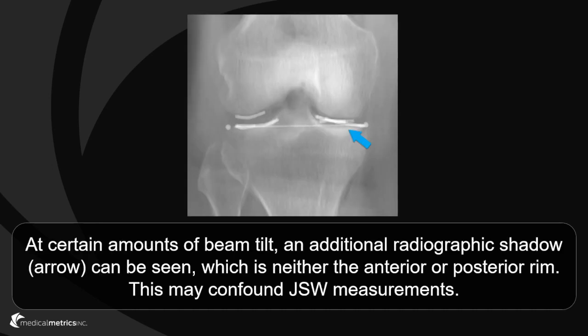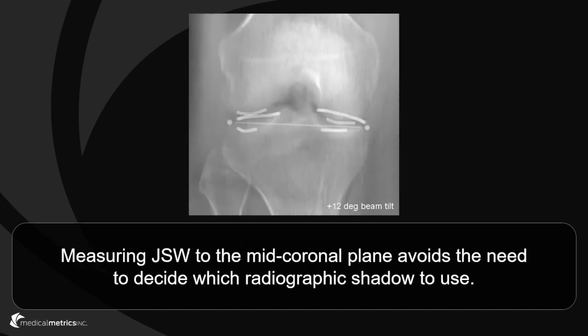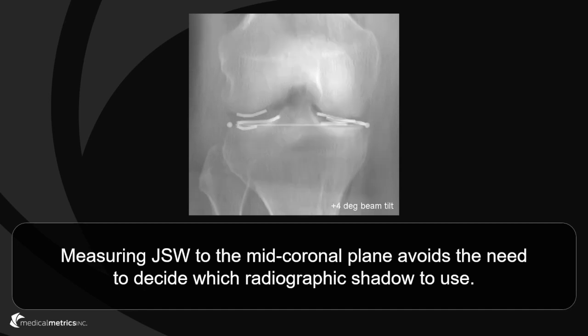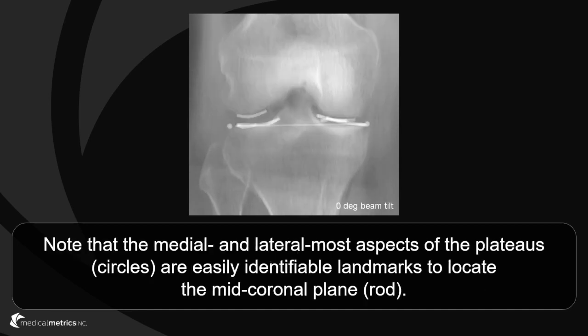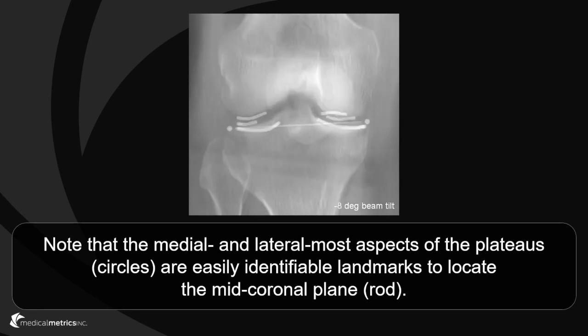At certain amounts of beam tilt, a radiographic shadow can be seen that is from neither the anterior nor posterior rims. This can confound joint space width measurements. Measuring joint space width in the mid-coronal plane avoids the need to decide which radiographic shadow to use. Note that the medial and lateral most aspects of the tibial plateau are easily identifiable landmarks to locate the mid-coronal plane of the tibia in radiographs.